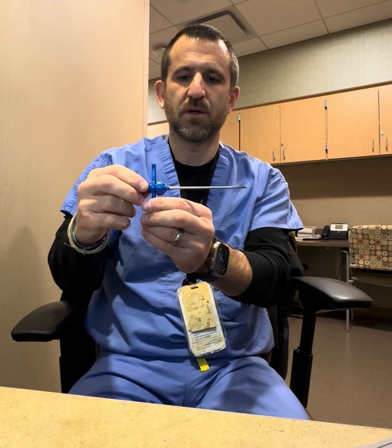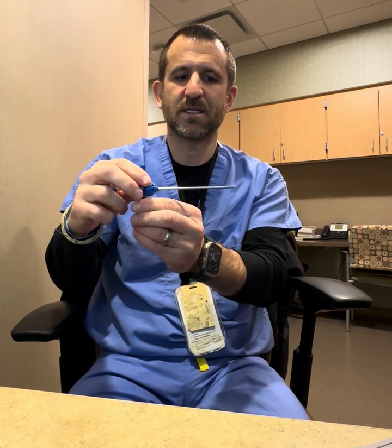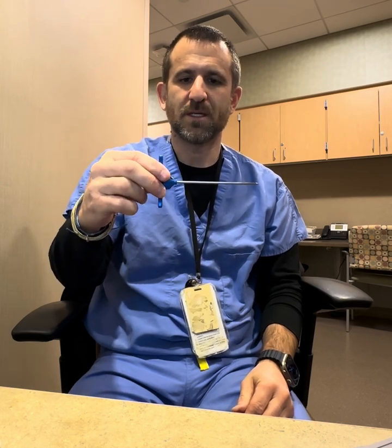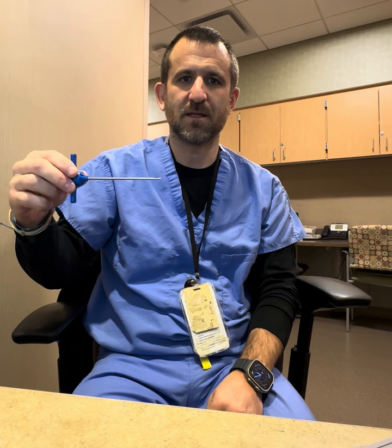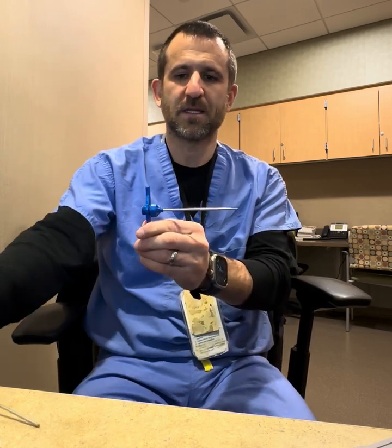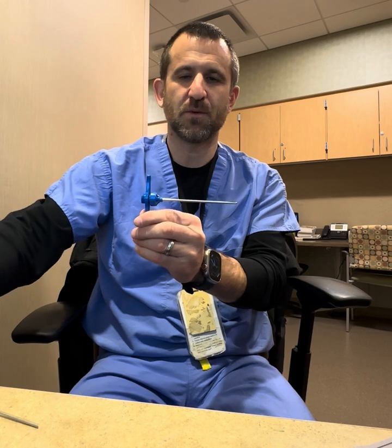Once this is into the bone, you can withdraw the stylus and then advance the tip of the Jamshidi needle further into the bone if desired. Once that's done, we retract the Jamshidi needle out of the bone, and at this point presumably there's a bone sample within the needle.